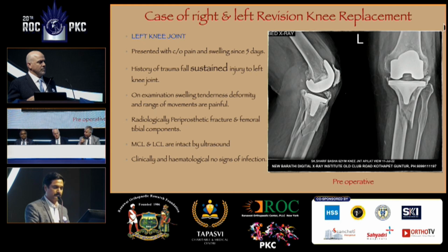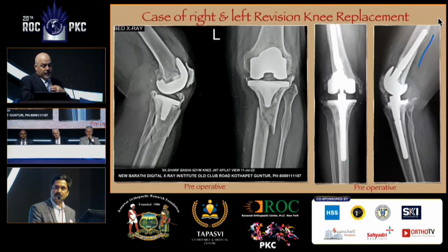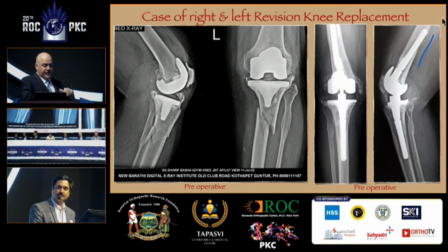My question, Arun, is why would you replace the patella? The patella is very thin, it's very sclerotic, and if you put in a patella resurfacing there, the danger of fracturing the patella is quite high. I agree with that. In my opinion, I would put a plate on first, unicortical, just to stay low. Because if it does displace when you're removing components, even loose components, it's difficult. You've got to hyperflex, you've got to do stuff to that leg, and you can make this much more complicated. So let's see what you did.